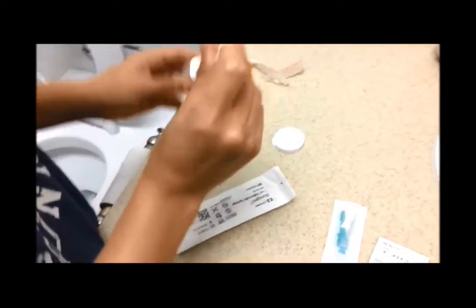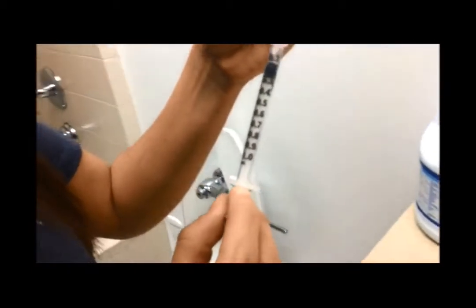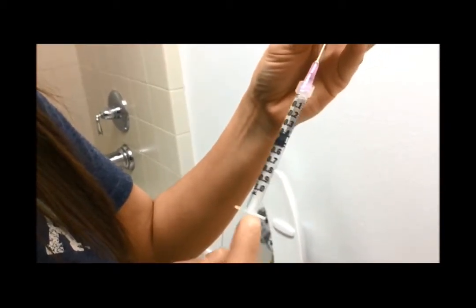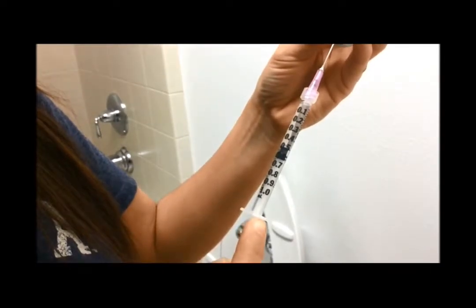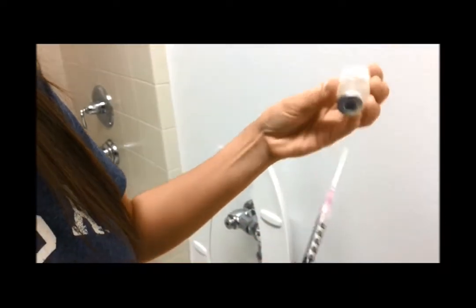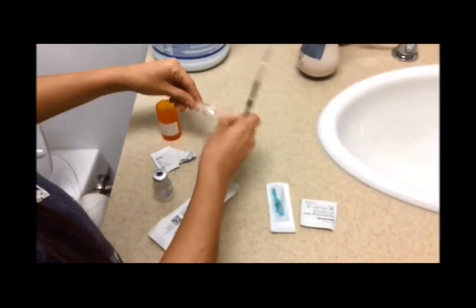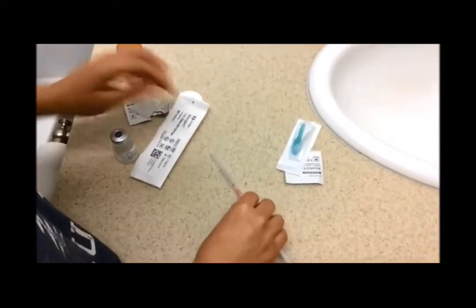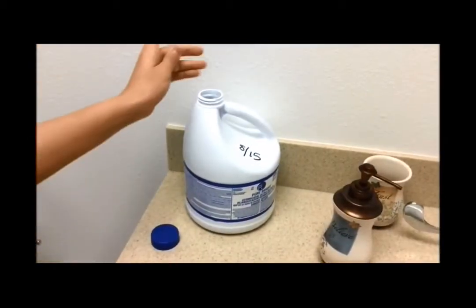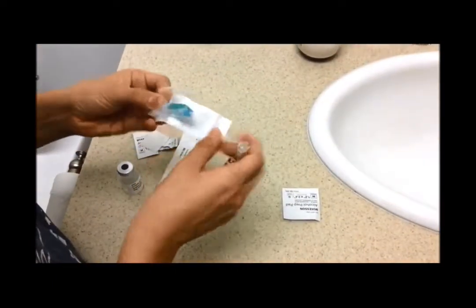Grip your syringe like a pencil, uncap the needle in a fluid motion, and puncture the vial. Then push the air in, flip the vial upside down, and pull back the plunger to draw medication into the syringe. Make sure there are no air bubbles by tapping the syringe to get the air to the top, and then push and pull back until there is only medication in the syringe. You can draw back more medication and then push until you have your correct dose. Finally, recap your needle by scooping it up and securing it, then switch to your injection needle by twisting off the 18 gauge and twisting on your 23 gauge needle, and set this aside.